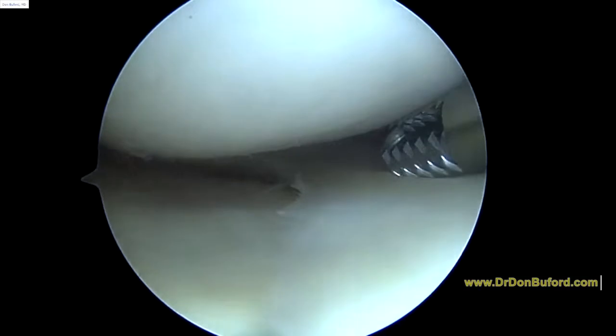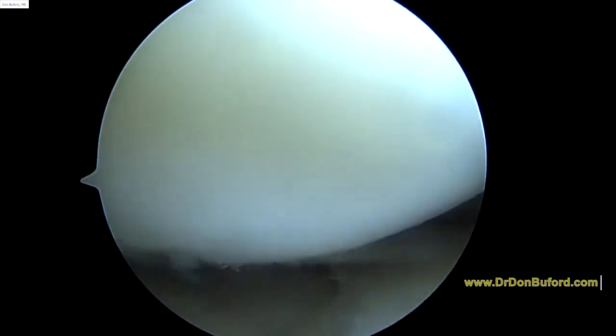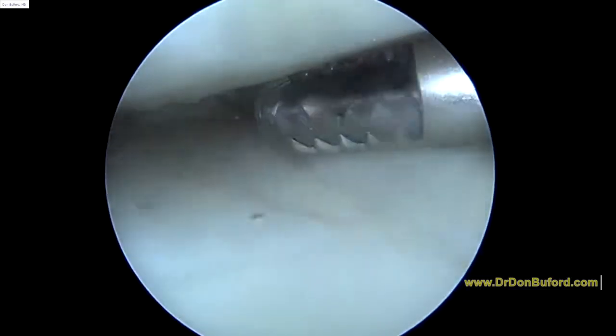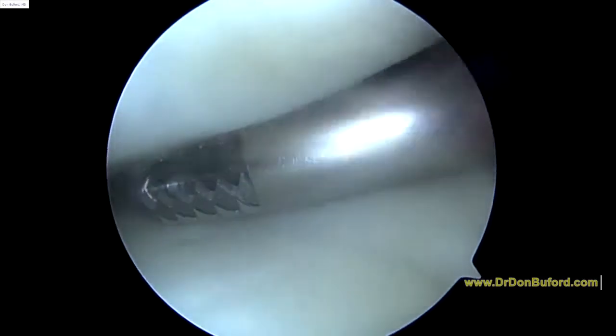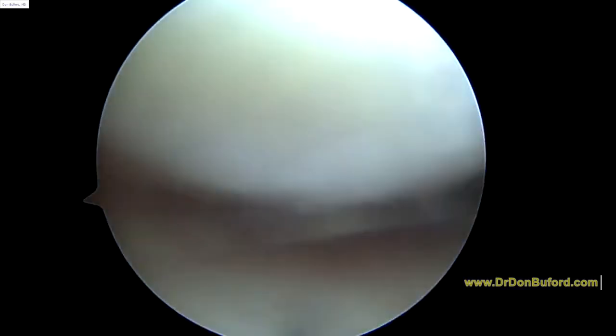If I can do that, we'll get a better view. This is kind of the anterior horn and body of this medial. It looks okay. So you can see this anterior horn in the medial meniscus — this looks good. Body looks good.